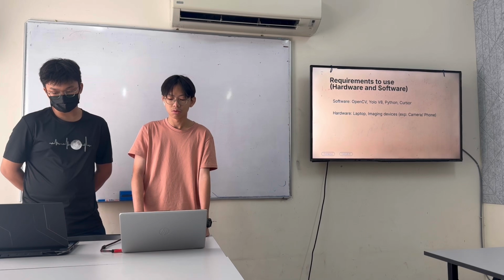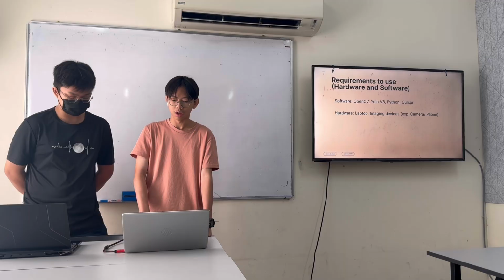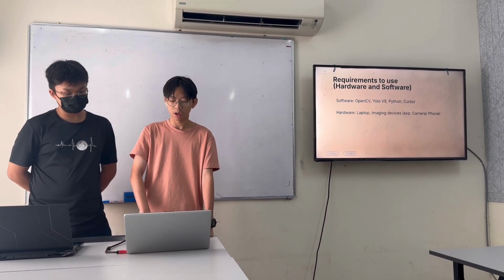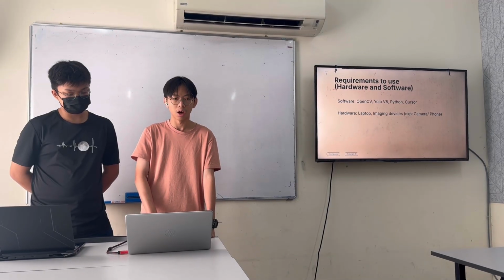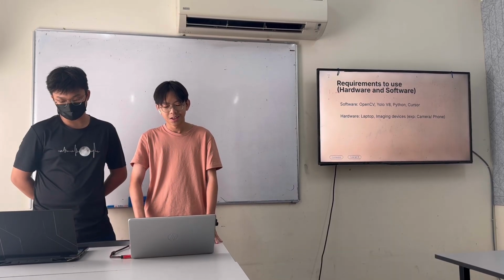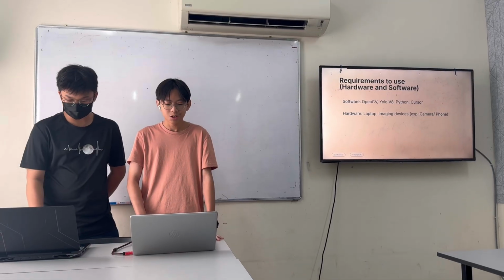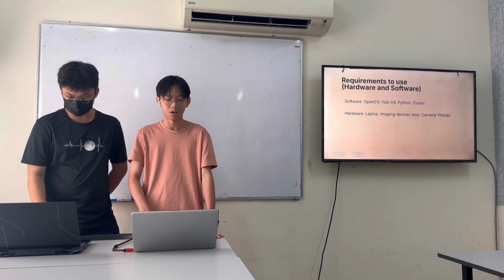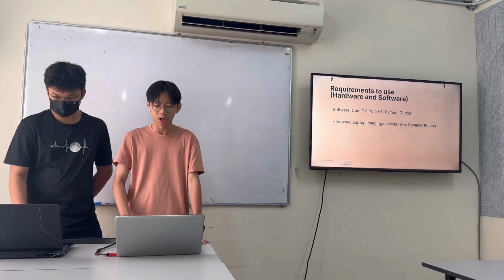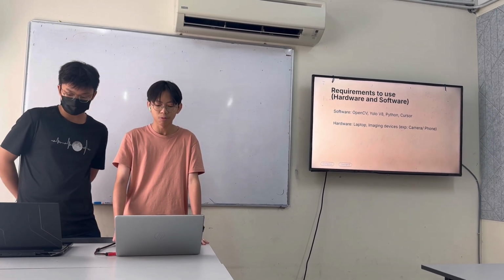Cursor is used to run the website. YOLO V8 is just to identify the thing, and it will create a square around the diagnosis, like maybe a tumor, cancer, or fracture. And OpenCV we will use to change the tones and colors and make the image much clearer.